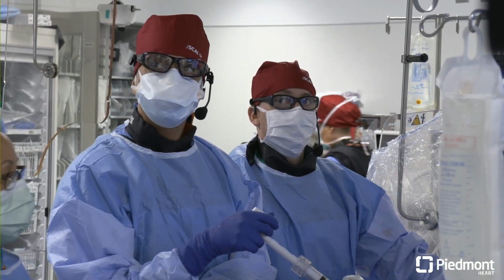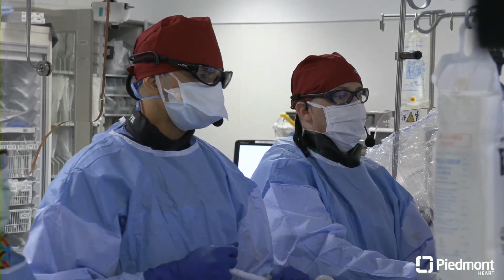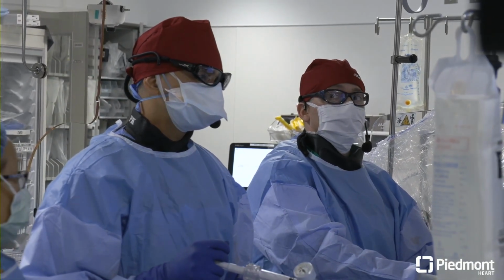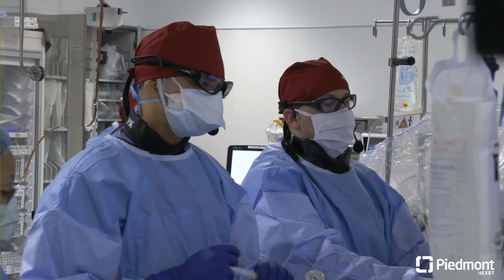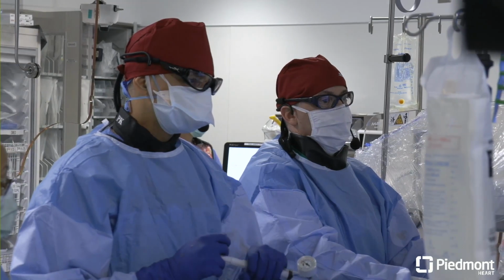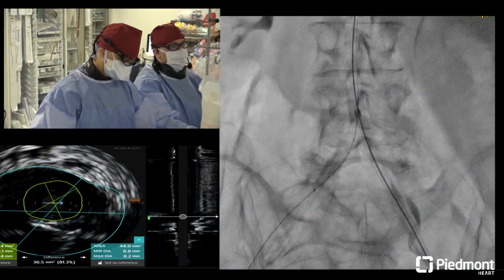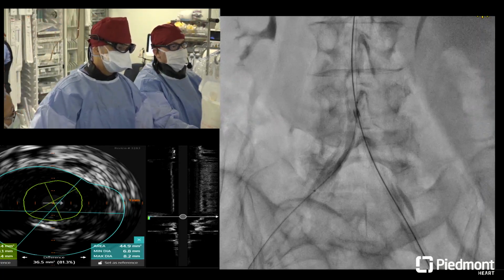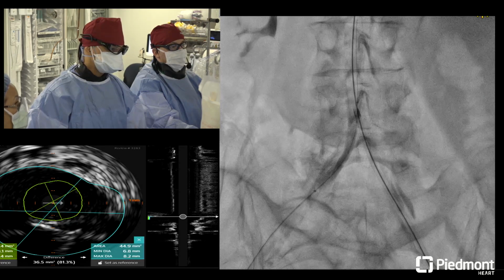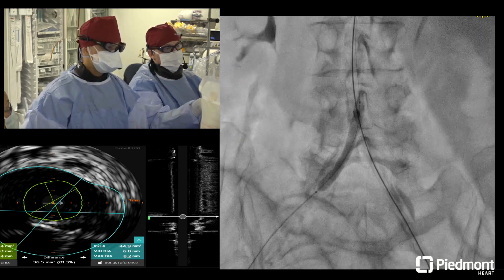Kenny missed the question there. Oh, about hand mounted. Do you use this technique where you basically put the sheath way up and then unsheath it? Yes. That's the safest way to get in there. The newer stents embolize less. That's definitely true. But I think just for imaging purposes, it's nicer to have a longer sheath up. It's a big thing I teach my fellows: always bring that sheath back over your balloon when you're done and keep it past your area of treatment.